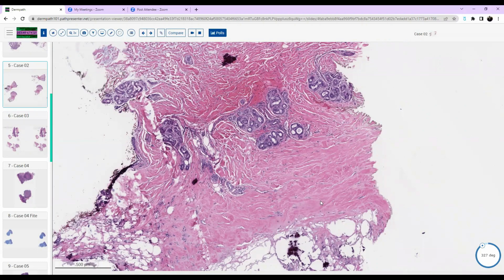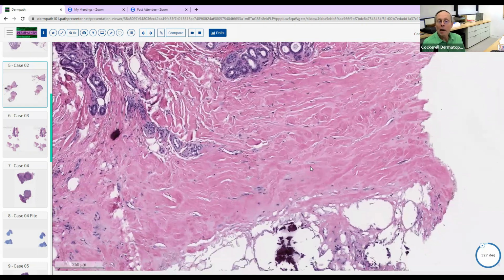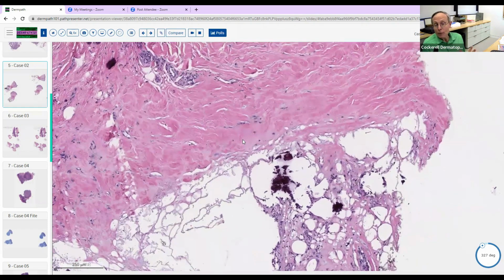So would that possibly be an explanation for something like this? Yes. It could be, right? So morphea profunda, which means morphea where you get the deep involvement, you don't necessarily get the overlying superficial dermal involvement, can get into the subcutaneous fat. Usually it doesn't give you this fat degeneration, the dystrophic calcification like this. So to me, this probably isn't just pure morphea. It's probably some type of an overlap, maybe between lupus and morphea. It's probably a combination of different connective tissue diseases here.